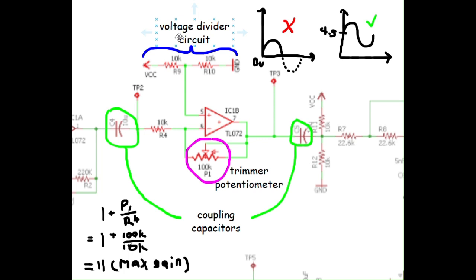The second block of the circuit shows us a variable gain amplifier with a negative feedback. The voltage gain is adjustable through the trimmer potentiometer. As there is negative feedback, a part of the output voltage is reverted back into the inverting input of the op-amp with a 180-degree phase inversion.